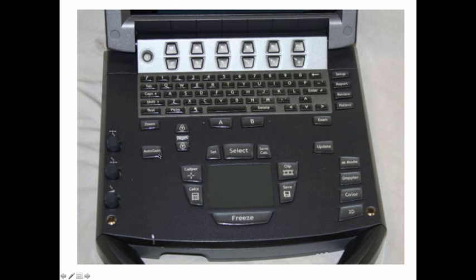Your presets will be based on when you click on this exam button, you'll pop up with a series of options. For example, if you pick up the vascular probe, you can optimize images for vascular imaging or nerve imaging. The cardiac probe can be optimized for either cardiac or abdominal, etc. So it's important to take a look at that if your image isn't looking quite as you think it should.